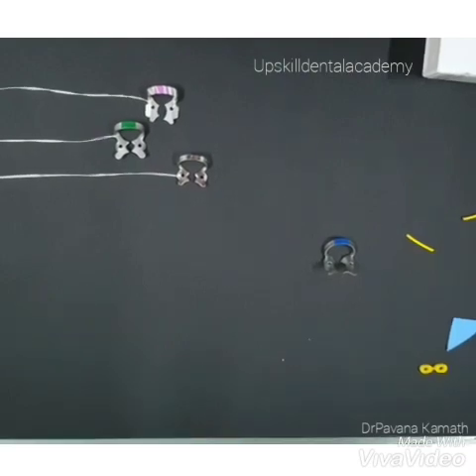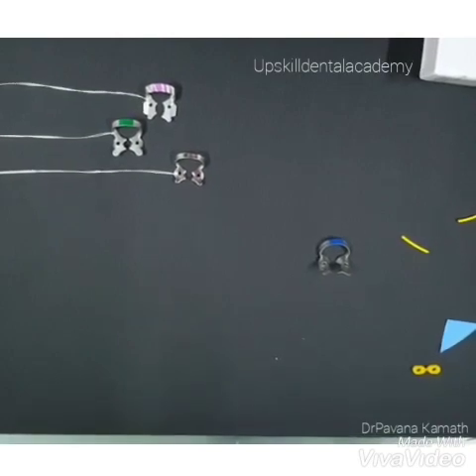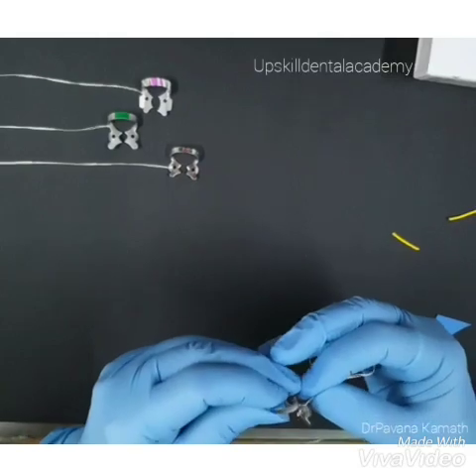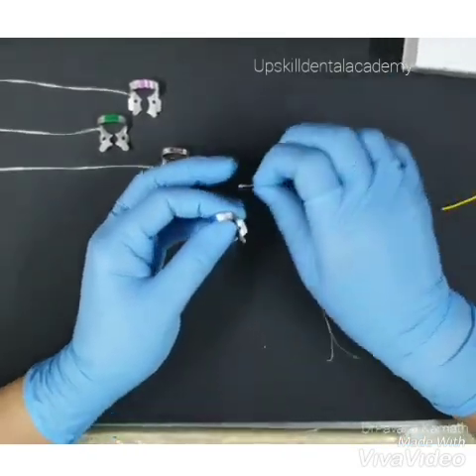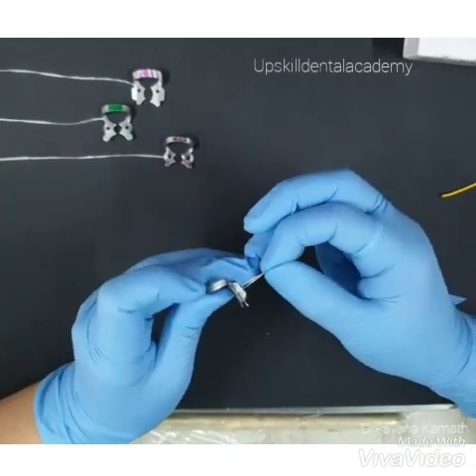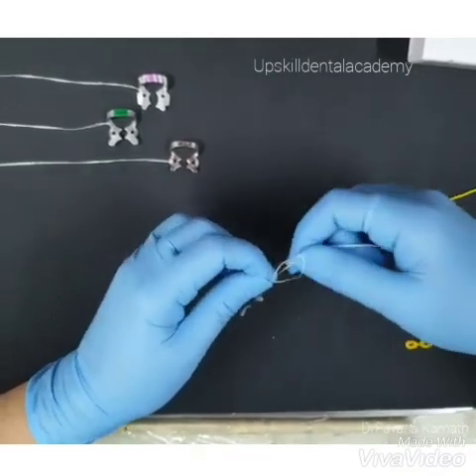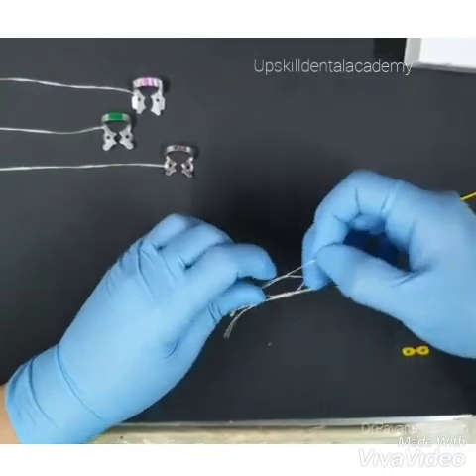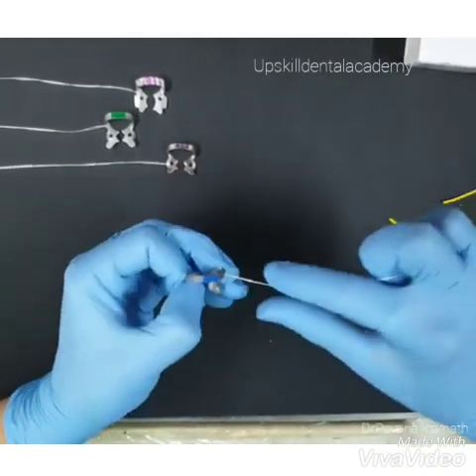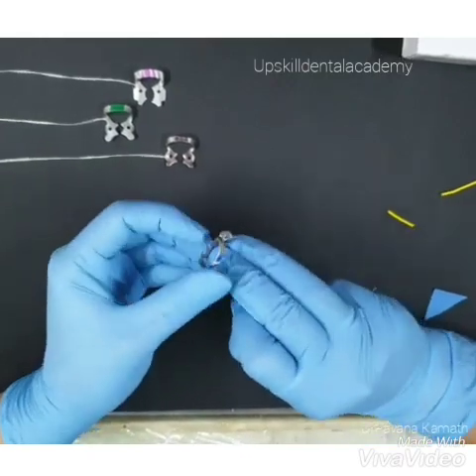Now another method of enveloping the jaw and the bow with the floss. It's pretty much the same, except that there would not be extensive wrapping of the floss around the bow, so it saves a lot of time. And then we wrap it around the bow. Just a few turns, and then move it towards the buccal jaw and tie a knot around it.